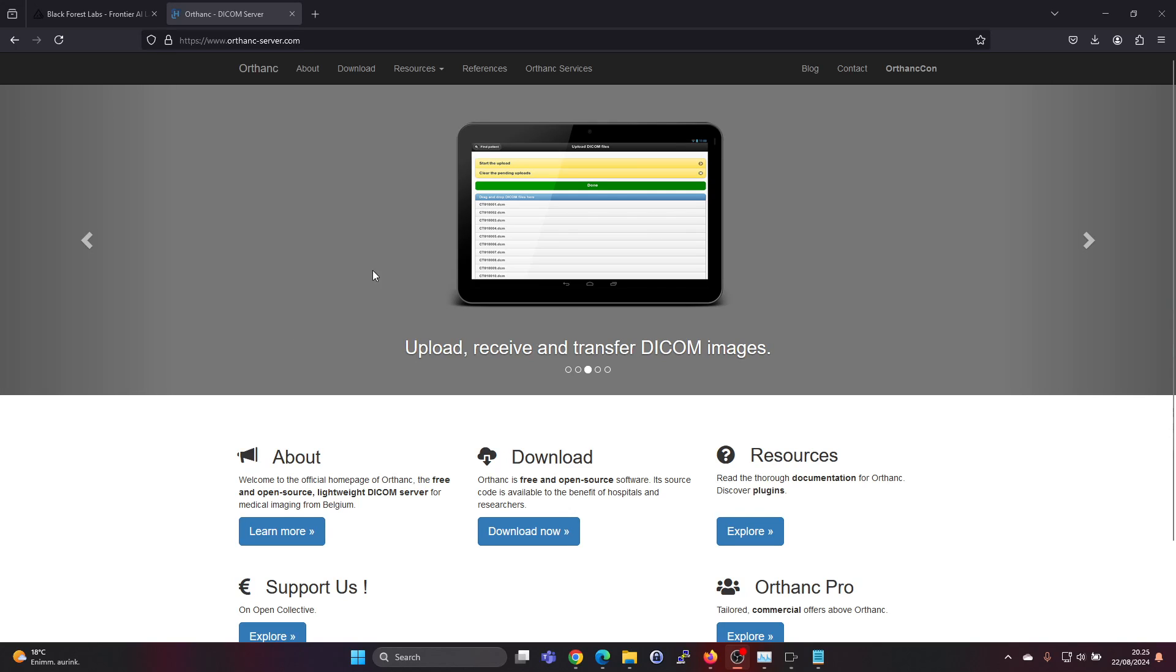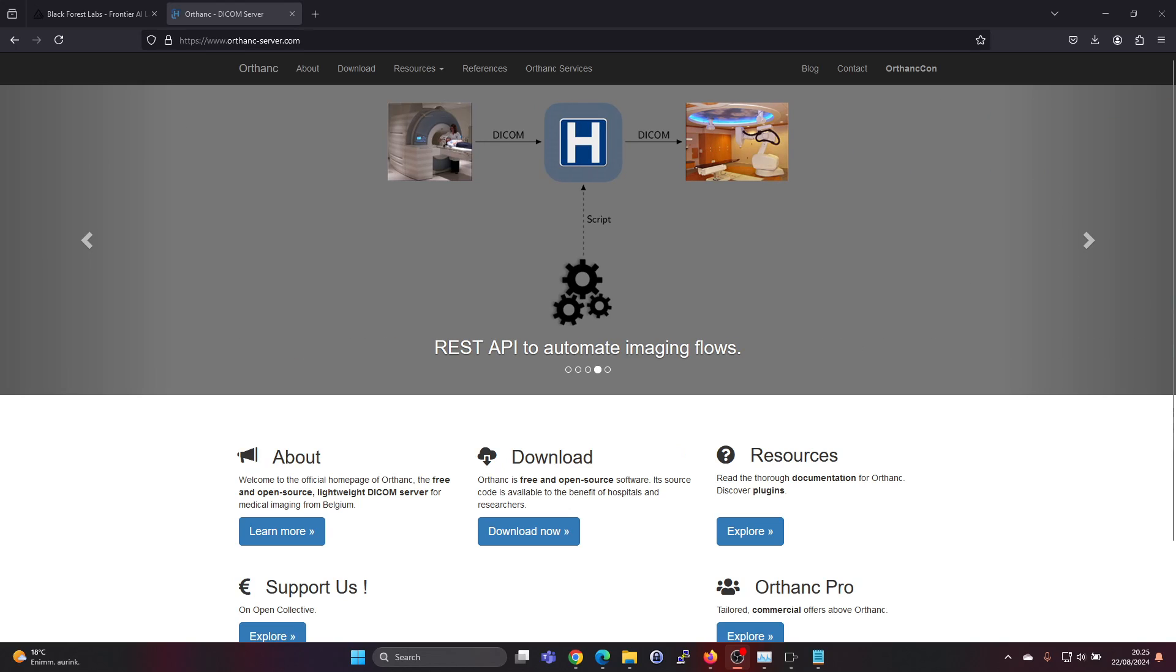Hey guys, in this video we'll be installing the Orthanc DICOM server in Windows 11.